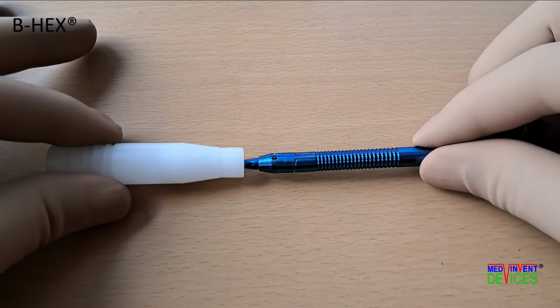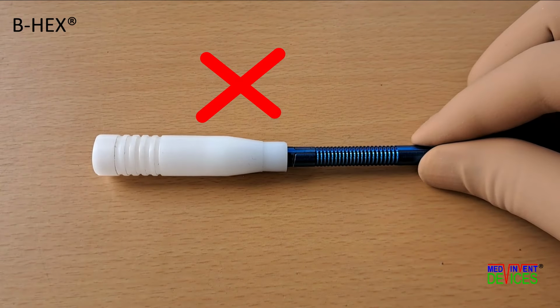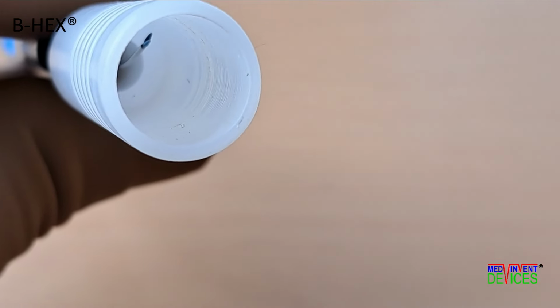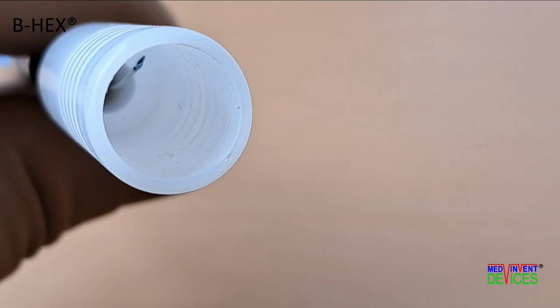If the cap is placed short of the squeeze arms, it remains loose, and will drop off during shifting or autoclaving, rendering the forceps vulnerable to damage. Moreover, the jaws remain open and have greater chance of getting damaged by striking the wall of the cap.